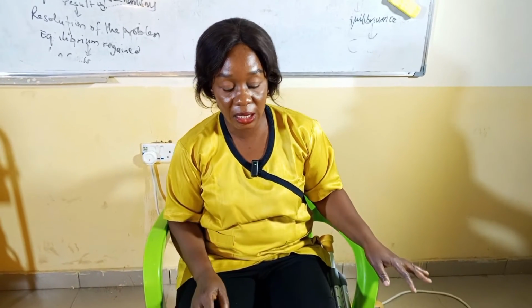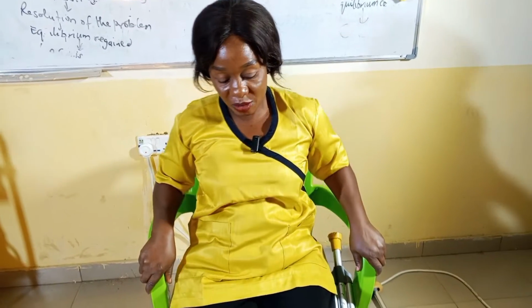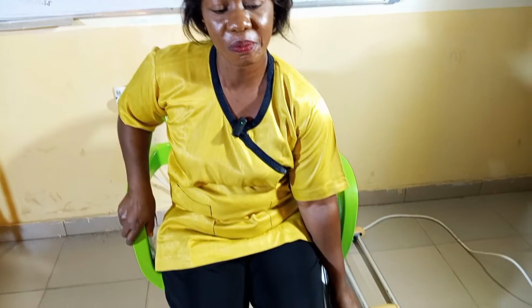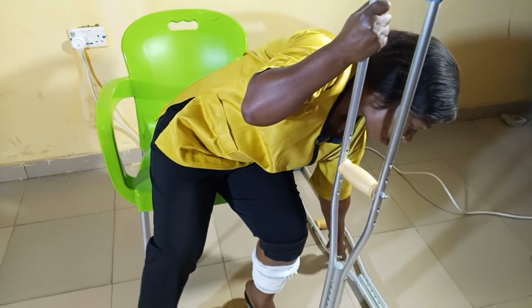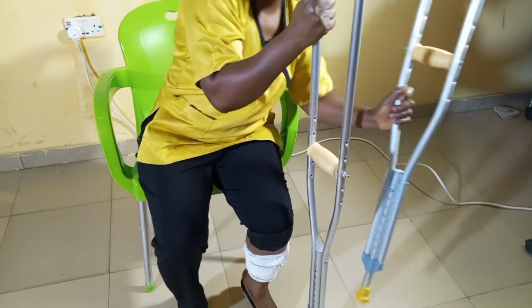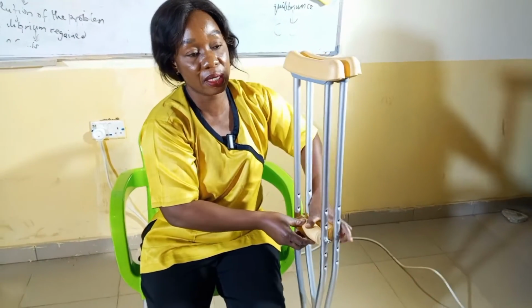Now, from sitting to standing, let's look at how to teach our patients how to do it. While doing from sitting to standing, you wear your shoe back, right? As the patient is sitting comfortably on the chair, encourage the patient to pull to the edge of the chair this way. Come to the edge of the chair and then lift the two crutches from the floor, making sure that the two crutches are of the same height, and then put them together.